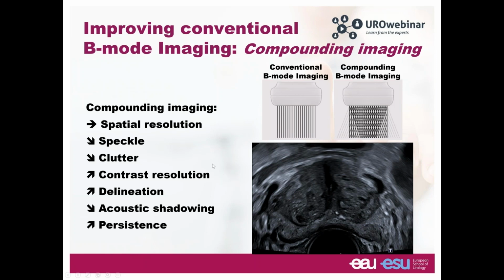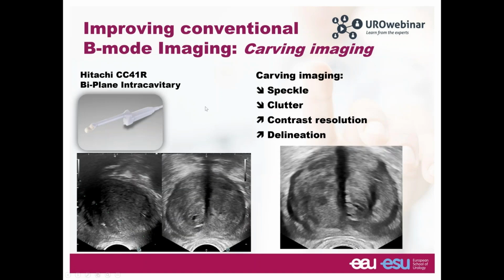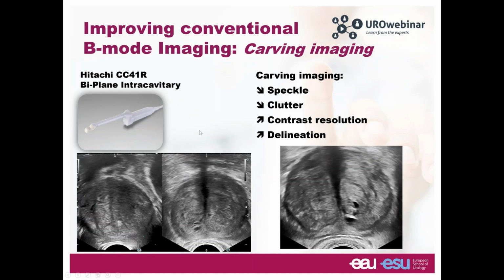posterior peripheral zone. New techniques can include the use of simultaneous biplane imaging, as you can see in this loop.